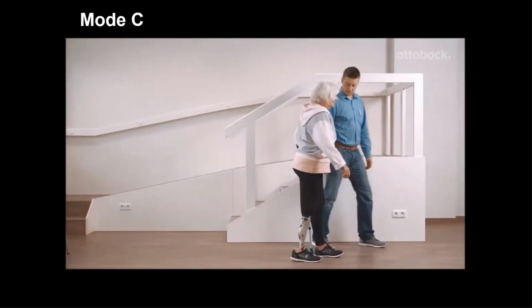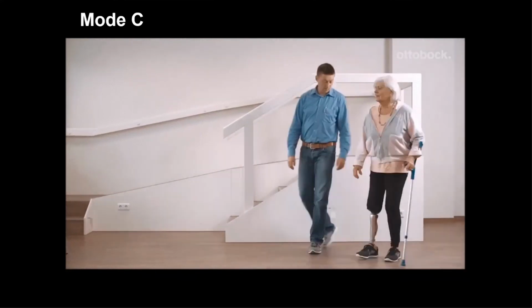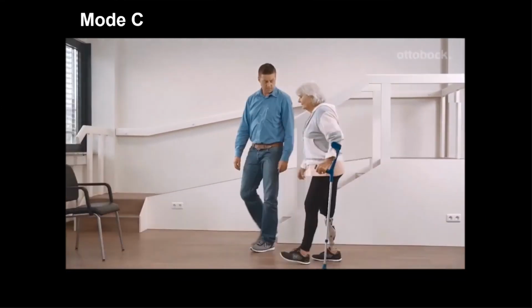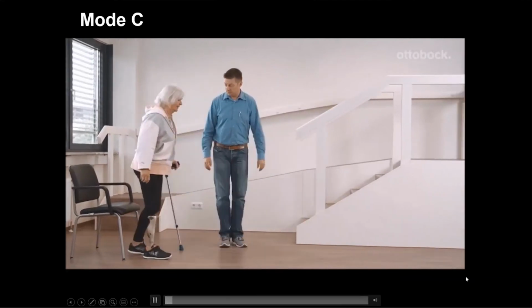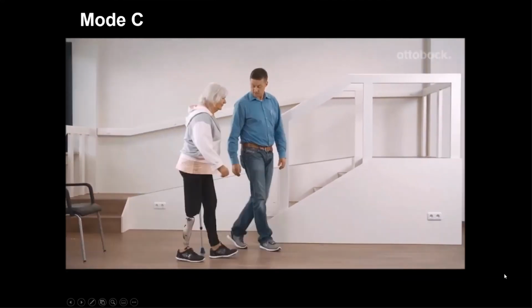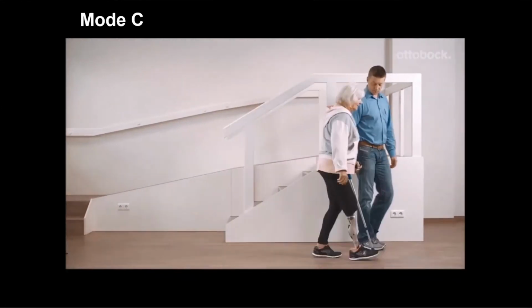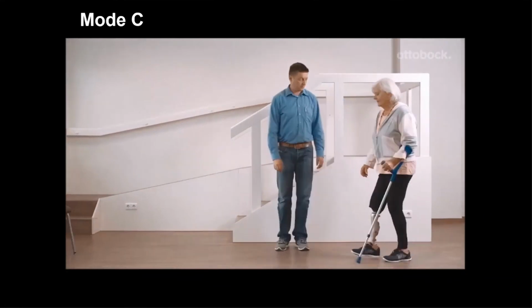They're getting older, they've been using a C-leg for 20 years, but they don't need all the functionality of it, and they walk at a slower speed. So this might be a good mode for them to use. And then those individuals who truly do walk at a slower speed, walk outside for less than a half a mile, those types of individuals, the Kenevo would be a good fit for them.